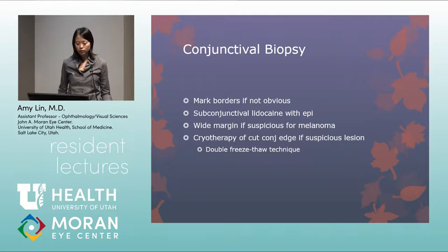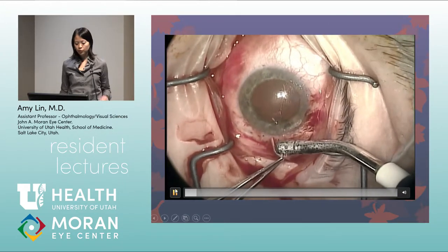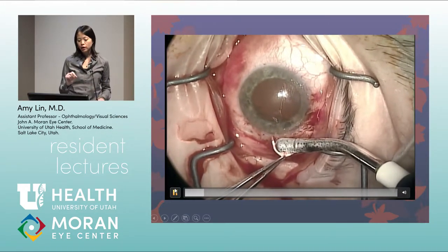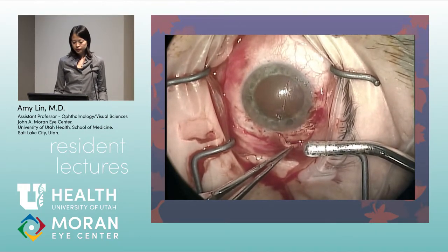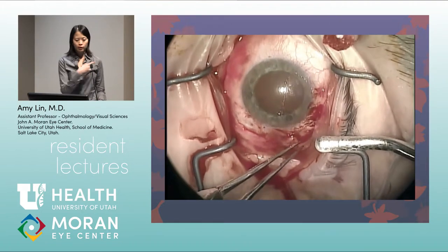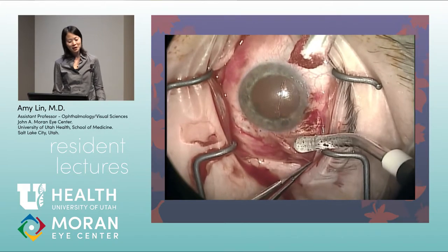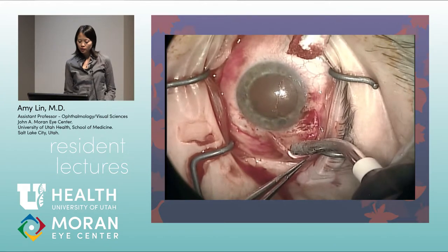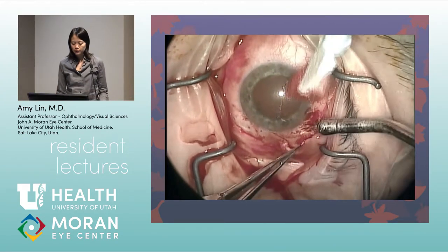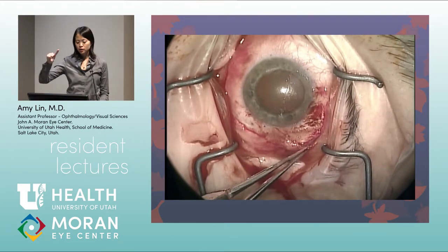The double freeze-thaw cryotherapy technique is used. The cryoprobe is placed just on the conjunctival edge — not on the sclera. The probe is lightly applied until it begins to freeze, then the foot is taken off the pedal to allow thawing, with overlapping spots across the conjunctival edge.